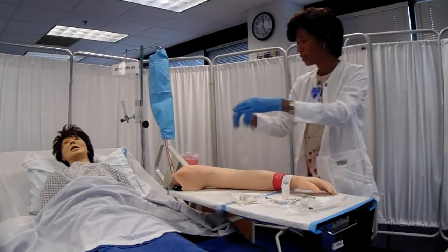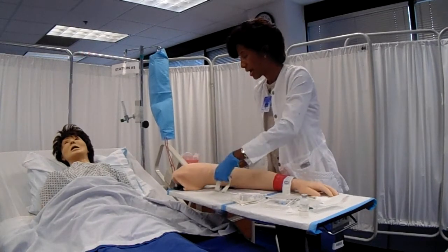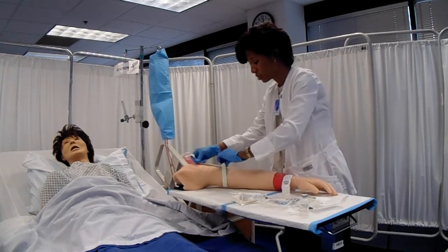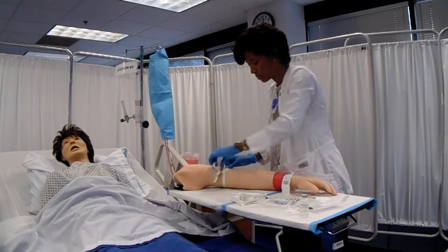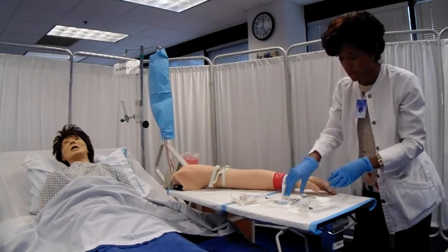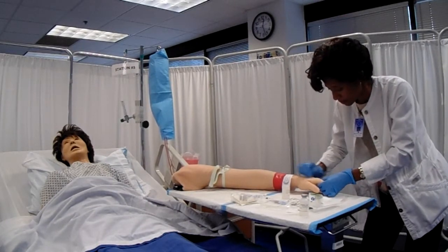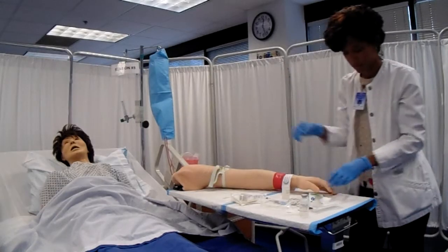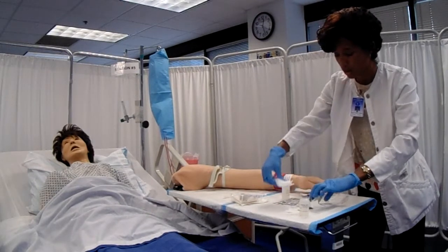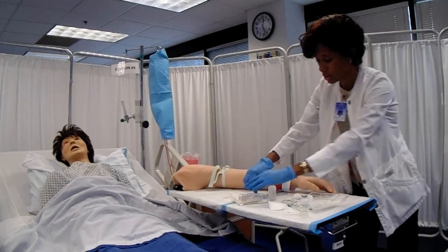Okay, this time I'm going to reapply the tourniquet. It's going to be a little tight. Let me know if you're uncomfortable. And I'm going to ask you to just hold your hand as steady as possible in place. Okay, let me go ahead. I'm going to clean the site. Alright. I also have here extra gauze pads in case of any small amount of leakage.